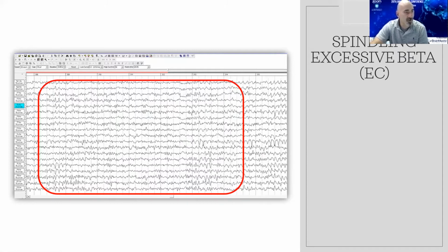And this is cortical in nature, generally speaks to over-arousal of the cortex. This person, in fact, suffers with deep depression. I think it's a very anxiety-driven depression where they're just overrun by the over-arousal of their brain.